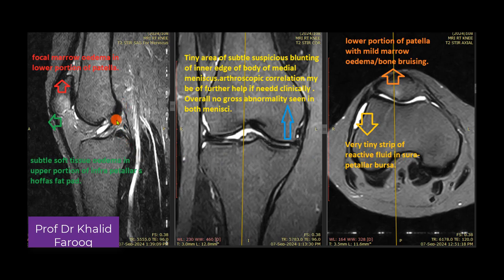Here we can see a normal anterior cruciate ligament, while the quadriceps and patellar tendons appear normal. There is a suspicious increased signal noted in the lower portion of the patella, suggesting marrow edema or bone bruising. Similar increased signals are noted in the anterior portion of the infrapatellar fat pad, suggestive of edema in this region.